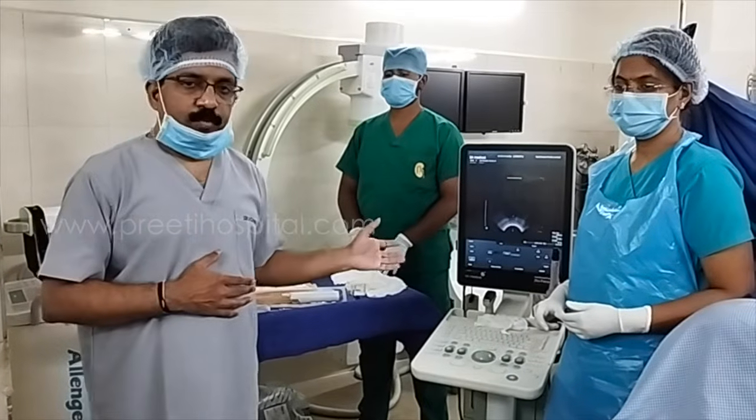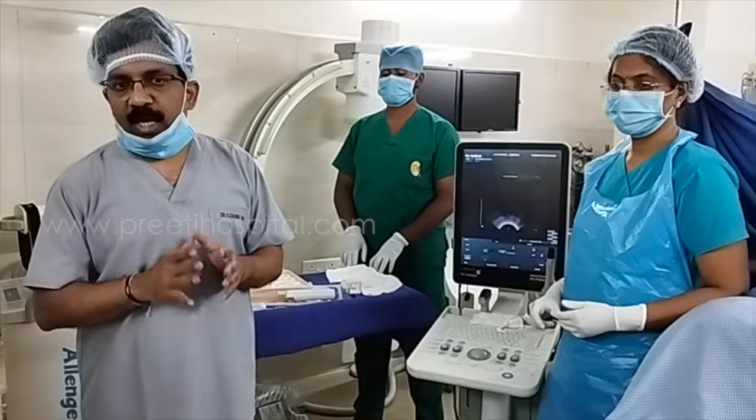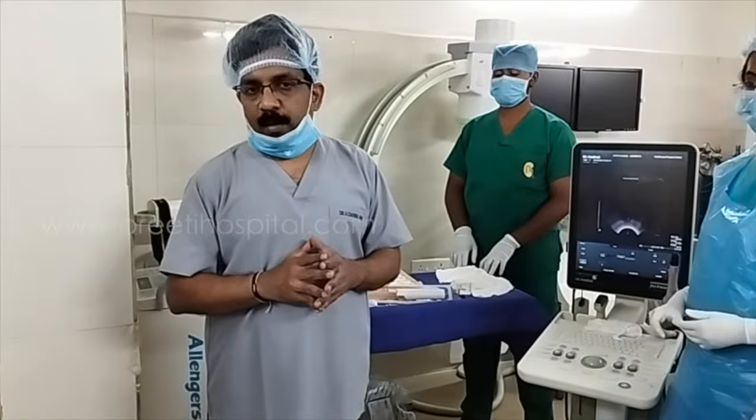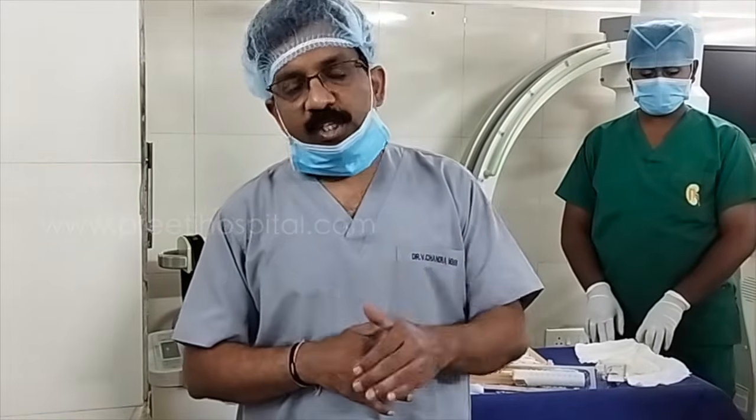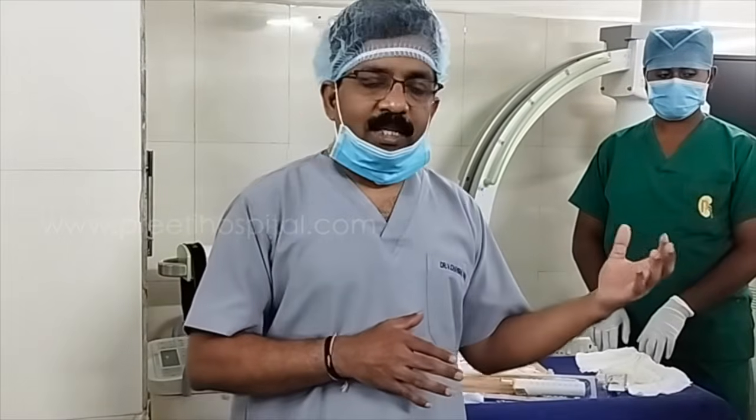It's not the question of the BK machine. If any machine has a biplanar approach, it is better. Most of the Indian machines have a trajectory, but biplanar will not be there. When we have taken this machine, we could understand what is the transverse plane, what is the sagittal plane, what is the axial plane. In fact, all the details practically we are discussing here.